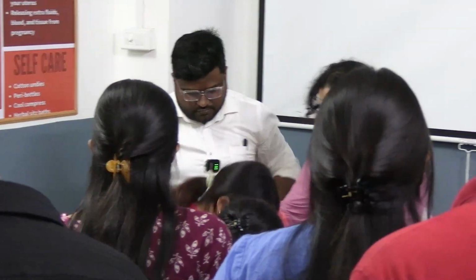The scissors are not held. Another finger, third finger, always. No, you're not holding the scissors correctly. Somebody hold the scissors correctly for her. Yes. You supinate your fingers, always. Be comfortable. Come in front. You are the operating surgeon. No compromise. You take your seat, take your position and do it.